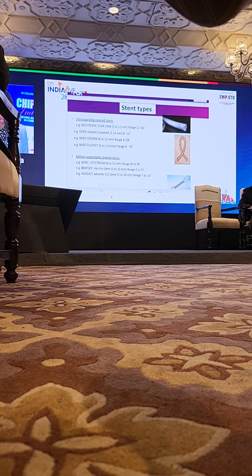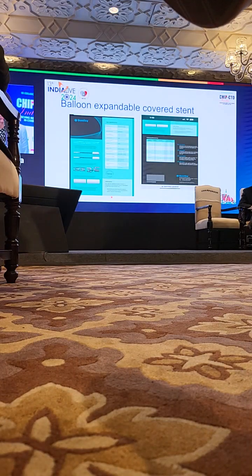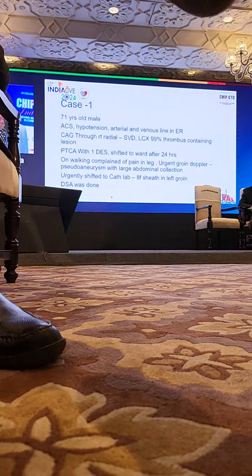These are the self-expanding stents. You have Viabahn, Covera, and BARD Fluency stents available. And these are the balloon expandable stents. This is the BeGraft, which goes through a 6F. So I'll take you through a case.